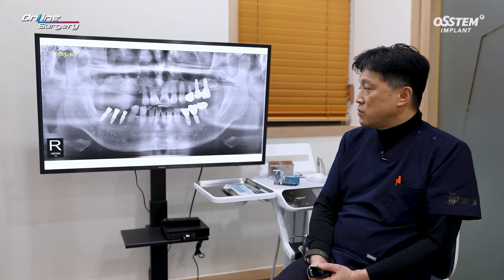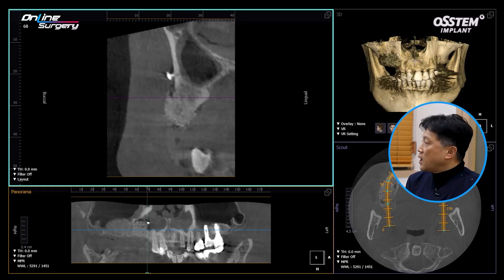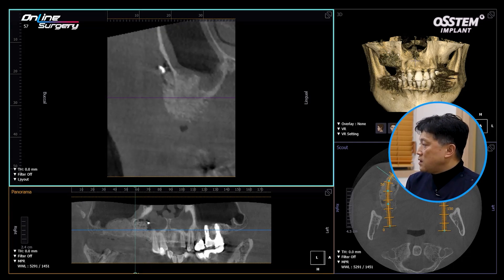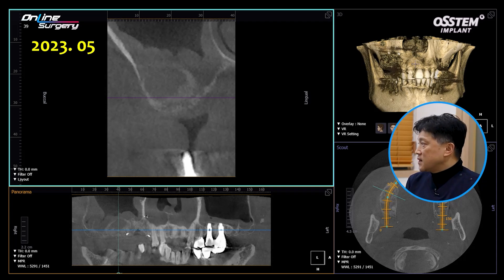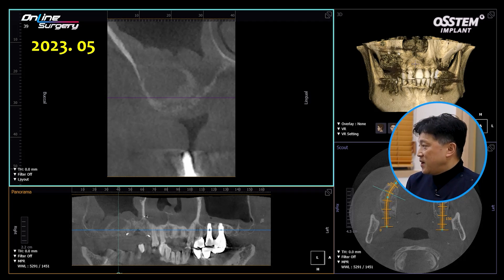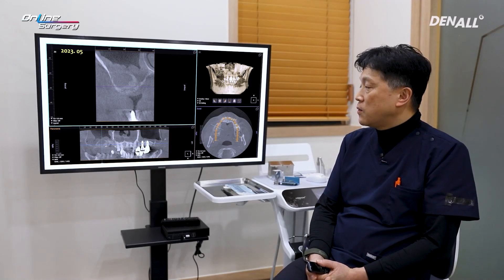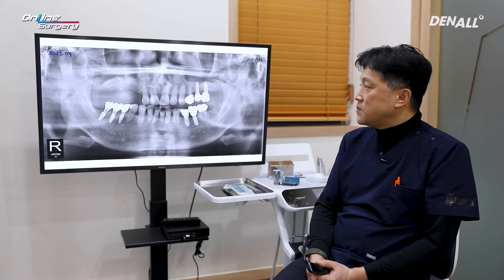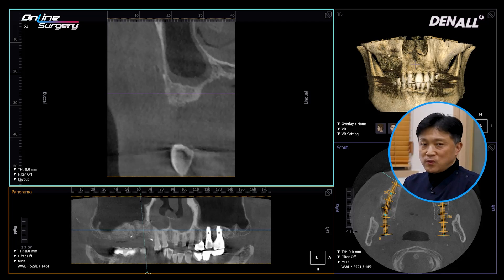Surgery was done in April 2023. This is the post-op panoramic image — there's bone tenting visible. Looking at the CT image, the graft materials appear to be situated ideally, and graft containment was done nicely as well. In May 2023, there was a bit of infection in the sinus graft material. The patient took Augmentin for four weeks to manage the situation. By September 2023, bone consolidation was somewhat achieved, but there was also resorption.